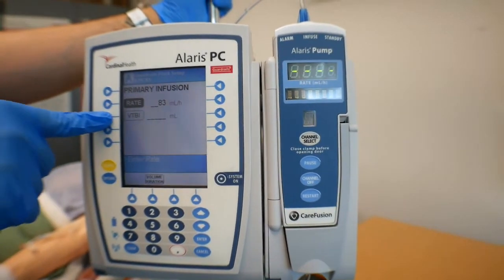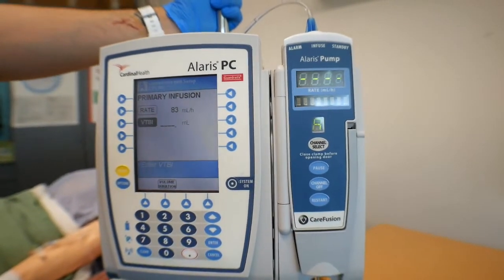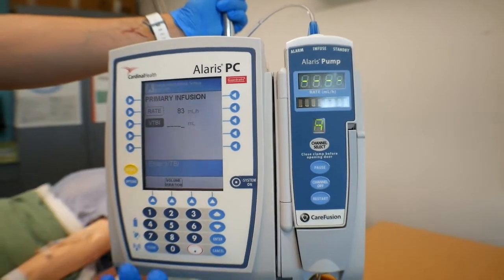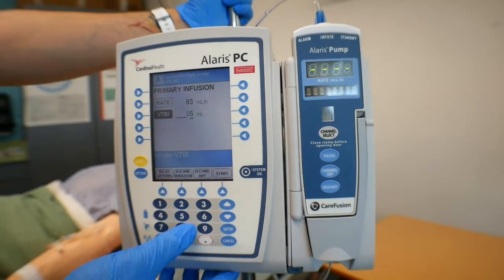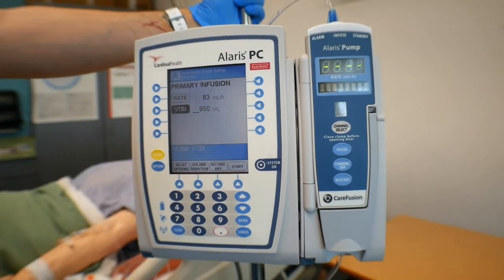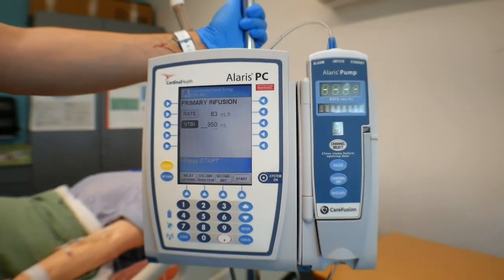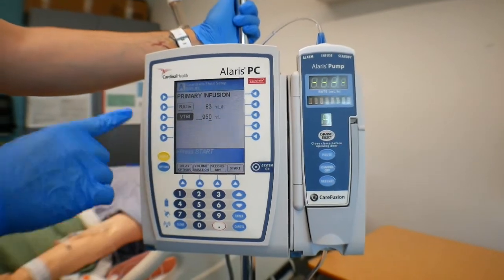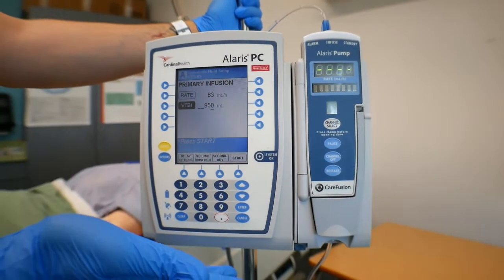And then volume to be infused. VTBI means volume to be infused. So usually for 1000 mils, I usually put 950 or 900. We do this so nurses will have ample time to get a new bag if it's still ordered, so you actually don't run out. Okay? So just double check that you have the right rate and the right volume to be infused.